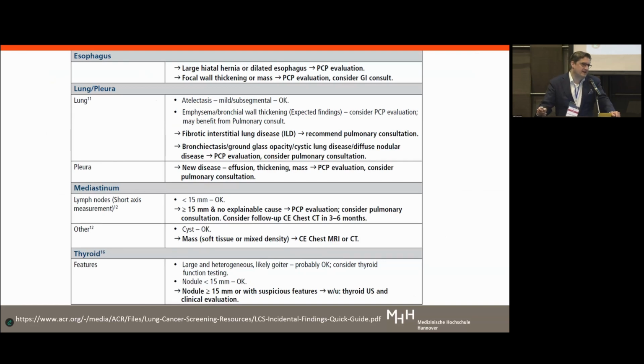Then a big topic, lung fibrosis and ILA. ILA is interstitial lung abnormality, which has been shown in up to 4%. They recommend to report it. I think there's some merit in that because you can treat it, and if you catch it early, you can do something about the course because, as you know, some of the ILAs, as IPF, is as deadly as cancer, nearly.